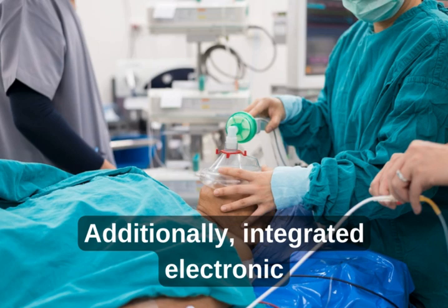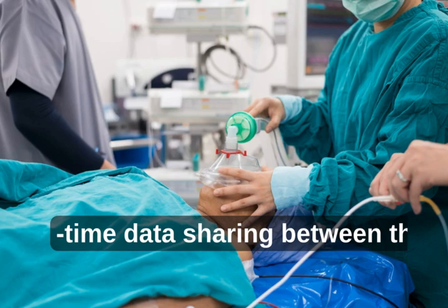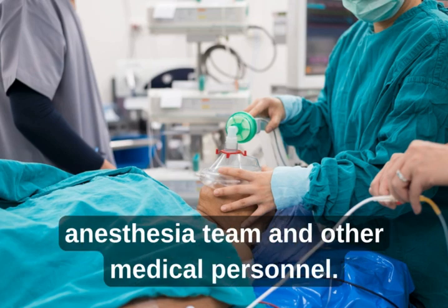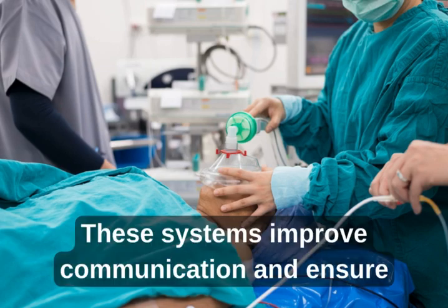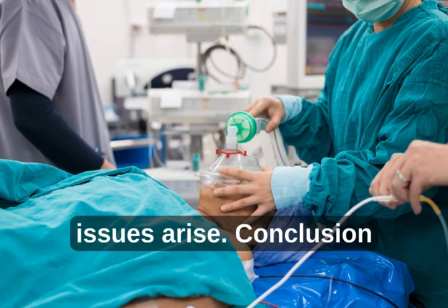Additionally, integrated electronic monitoring systems allow for real-time data sharing between the anesthesia team and other medical personnel. These systems improve communication and ensure that we can act quickly if any issues arise.